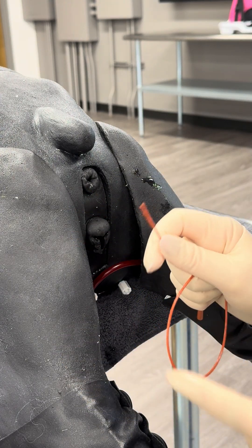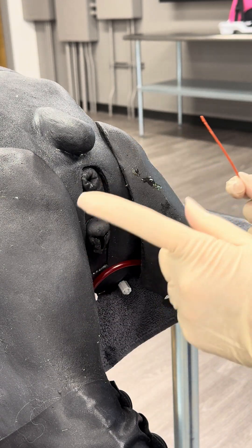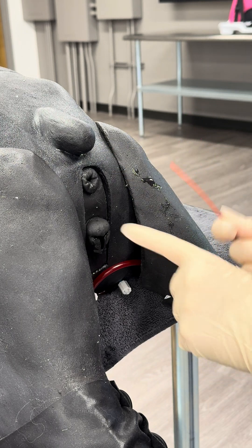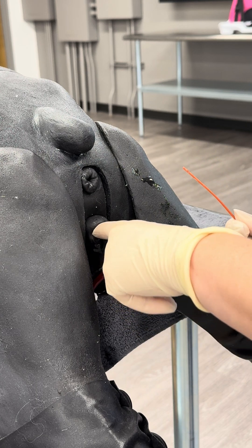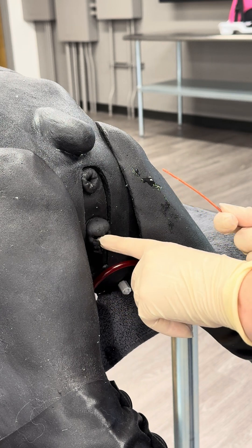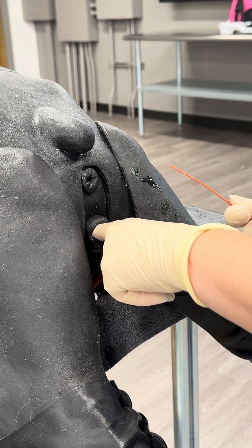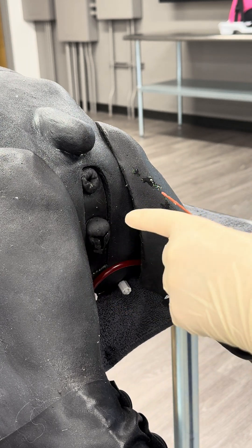I'm going to take my red rubber catheter, and I already have it nice and lubricated. I also have my non-dominant finger lubricated. This dog is a sizable dog, so I am able to fit my finger comfortably inside of the vagina without causing too much patient discomfort. If this was a small dog or a cat, I would not be able to use my finger to guide the catheter — I would simply have to know my anatomy and do this blindly.